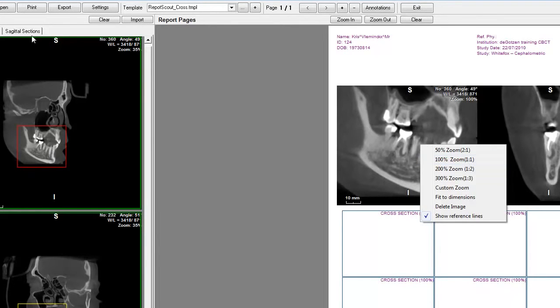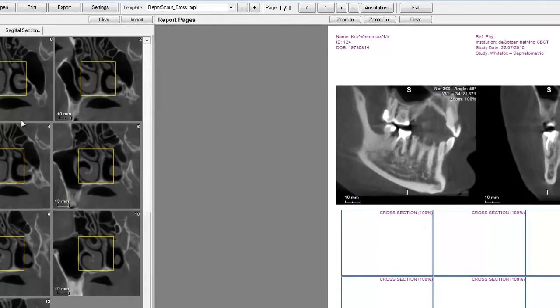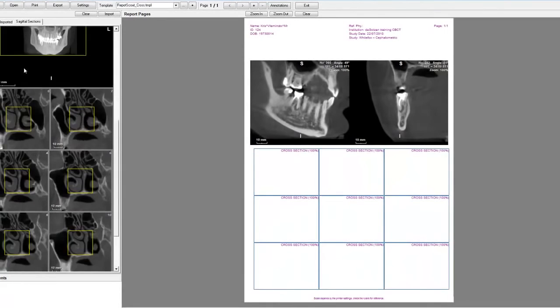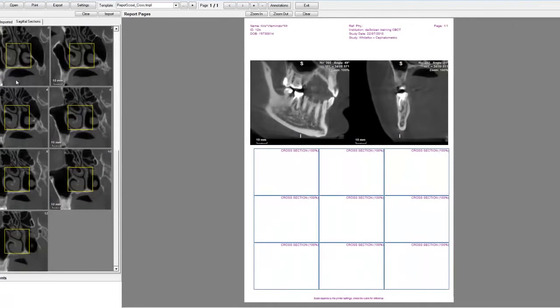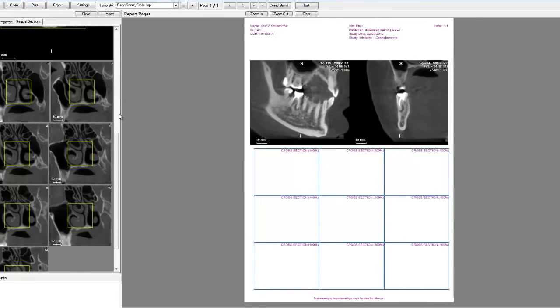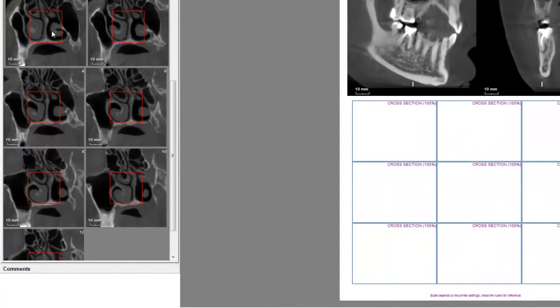Now, with groups, for example the sagittal section, things are a little bit easier and you can go a little bit faster. As you can see, we have here 7 images, and here 9 cross-section possibilities. So let's take them, all of them. What I do is exactly like you would select different files on Windows. That means that you select the first, Shift, select the last one, exactly like in Windows.